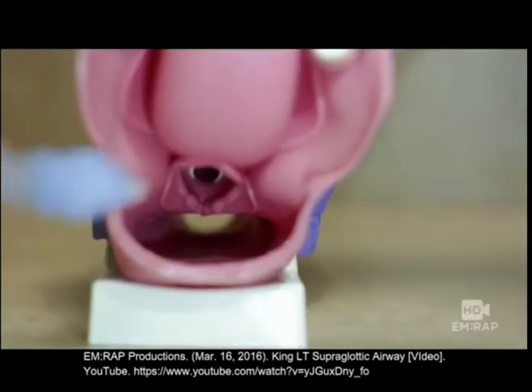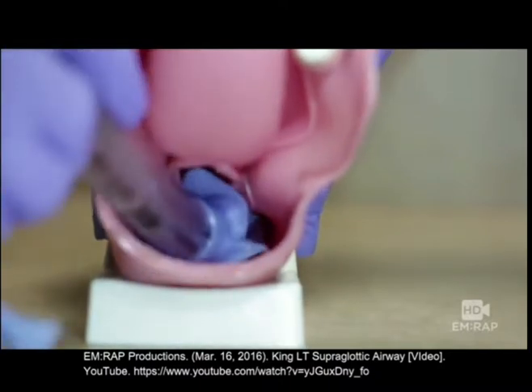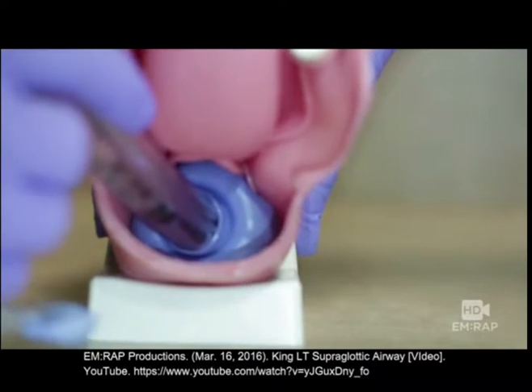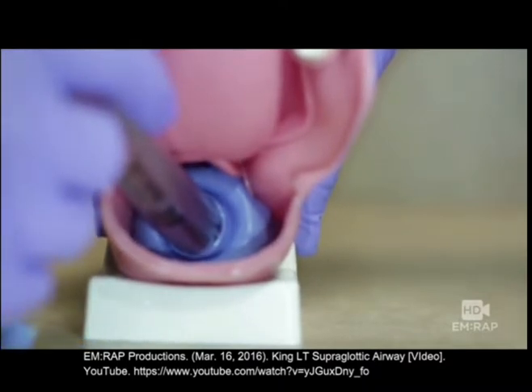Again, this is a blind esophageal intubation. So when you inflate the balloons, one's in the esophagus and the other is in the hypopharynx, which puts the ventilatory outlets right over the glottis.